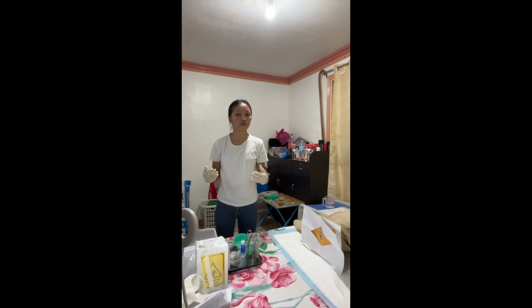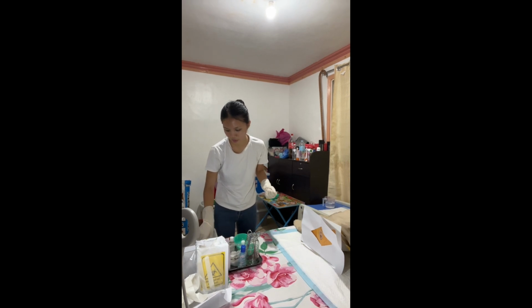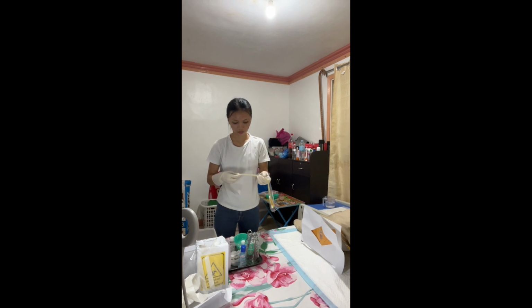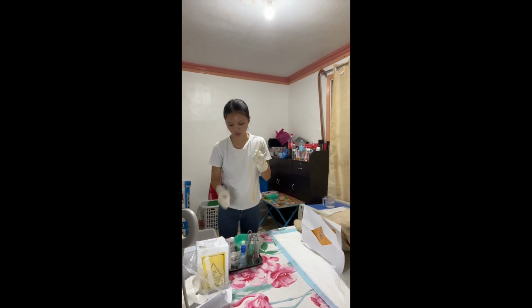Lubricant reduces the friction. So this is our lubricant, and we are going to get our catheter and then lubricate it.